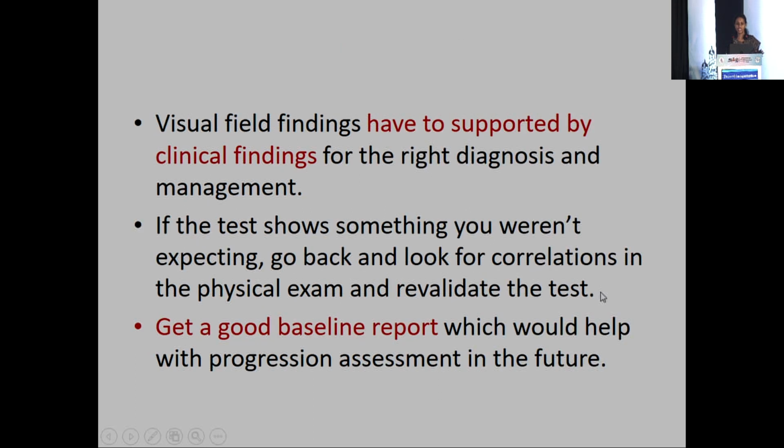Visual field findings have to be supported by clinical findings. If the test shows something you are not expecting, go back and look at your clinical findings again and then revalidate the test. Getting a good baseline report is important not only for diagnosis and management, but also for future monitoring.